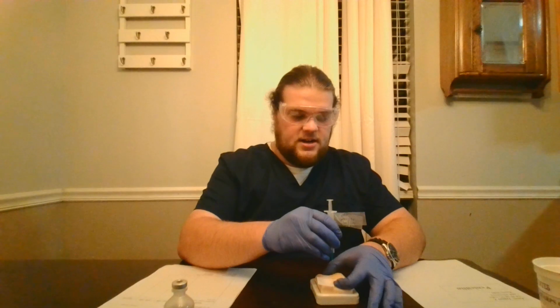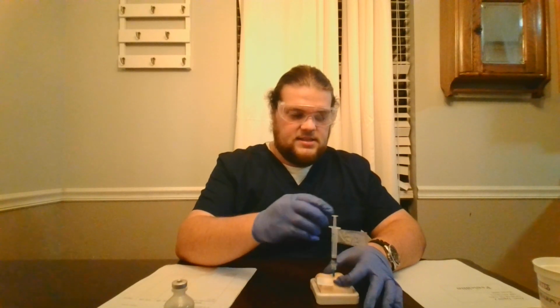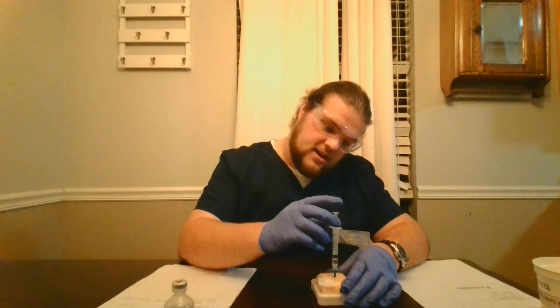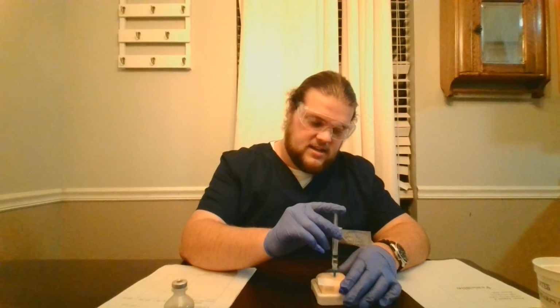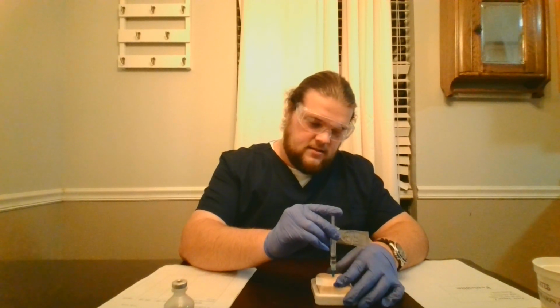Since this is intramuscular, I'm going to part the skin and pull it apart. I'm going to decap my needle. I'm going to part the skin, stretching it apart. And again, since it's intramuscular, I'm going in at a 90-degree angle. I'm going to dart in. And again, I'm going to aspirate to make sure I'm not over any veins or arteries or any blood vessels. I aspirated and I do not see blood, which means I can inject. So I'm injecting.